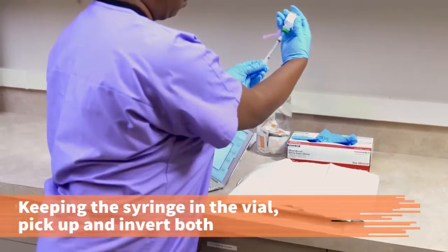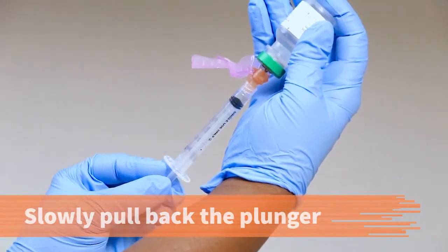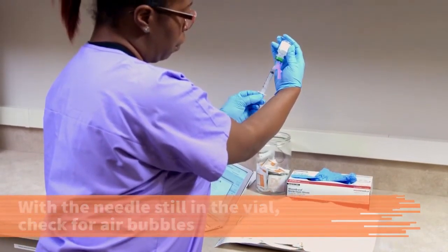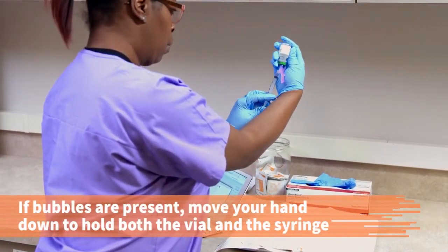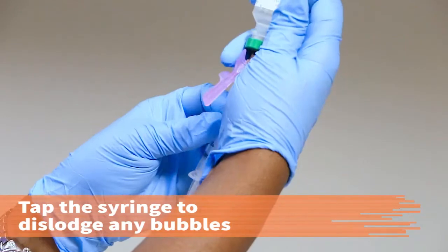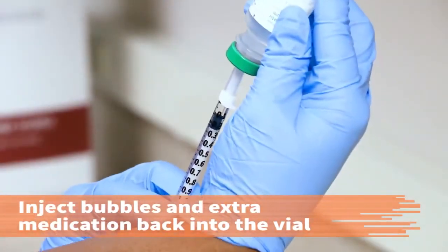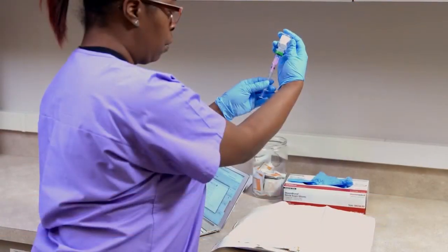Keeping the needle in the vial, pick up and invert them. Slowly pull back on the plunger with the unit at eye level and draw up more medication than ordered into the syringe unit. While the needle is still in the vial, check for air bubbles in the syringe. If air bubbles are present, move the fingers holding the vial down to grasp the vial and syringe as a single unit. With your dominant hand now free, use it to tap the syringe until the air bubbles dislodge and float into the tip of the syringe. Inject the air bubbles back into the vial with the extra medication that was withdrawn.